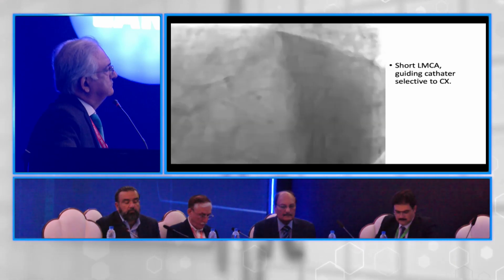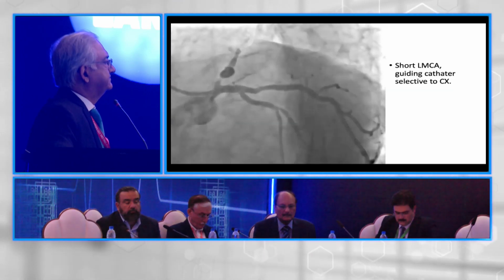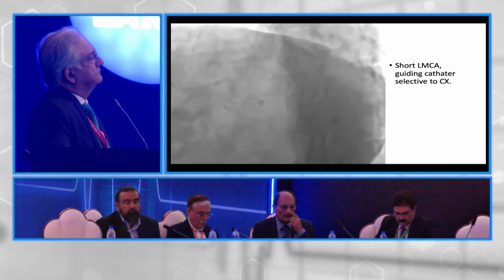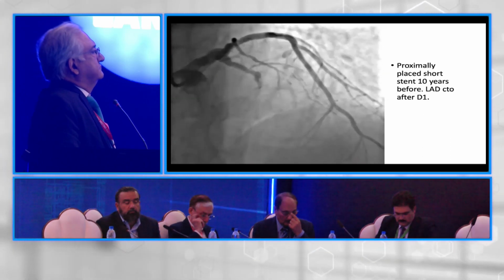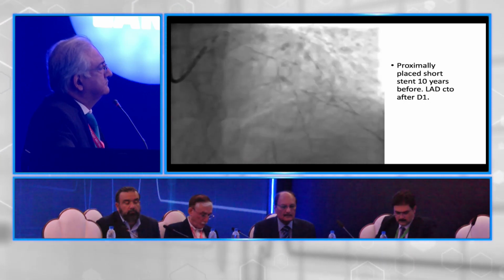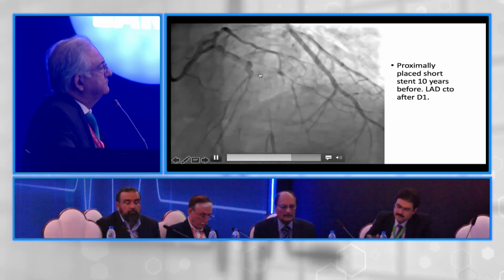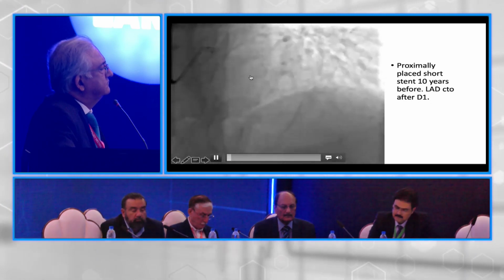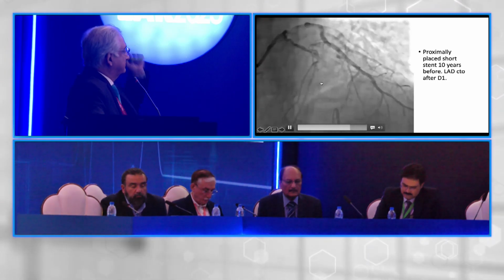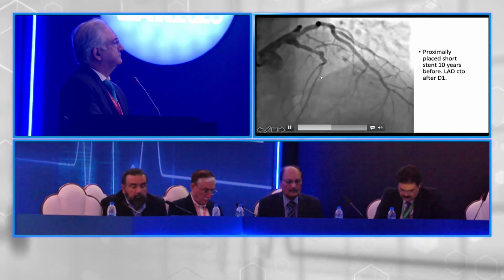So let me show you another antegrade CTO case. This is again an LAD CTO. We have a very short left main, and this is the CTO. And here I have a little bit of a question about where the proximal cap is. It could be either here or here. IVUS helped me a lot here, yes, to be honest with you.